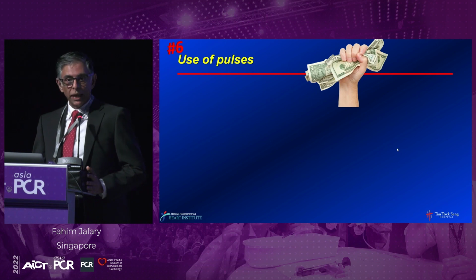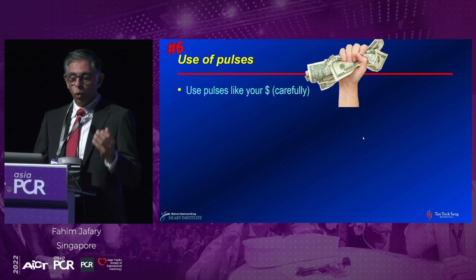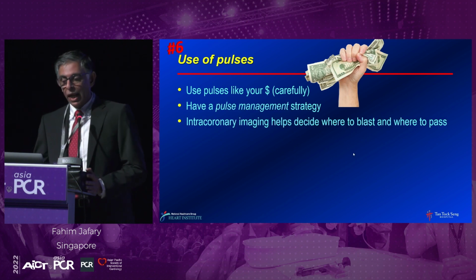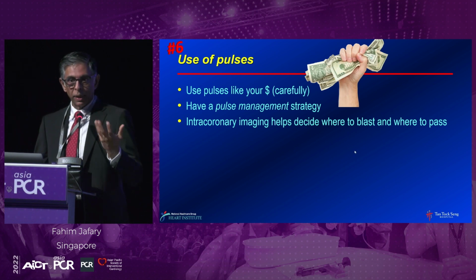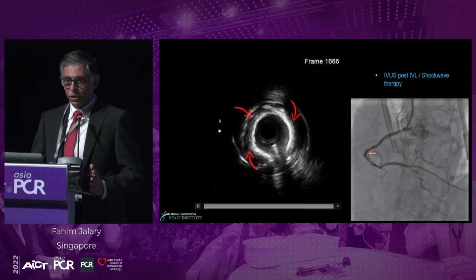And this brings us to the other point of judicious use of pulses. You think about pulses as your cash or your wallet. You have to use a pulse management strategy. And imaging helps you decide where to blast it and where to not blast it, because you have a limited number of pulses. And this is then imaging post-IVL, and I'm just going to show the brief part.